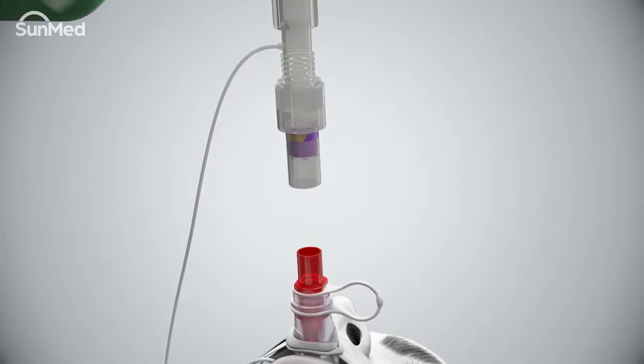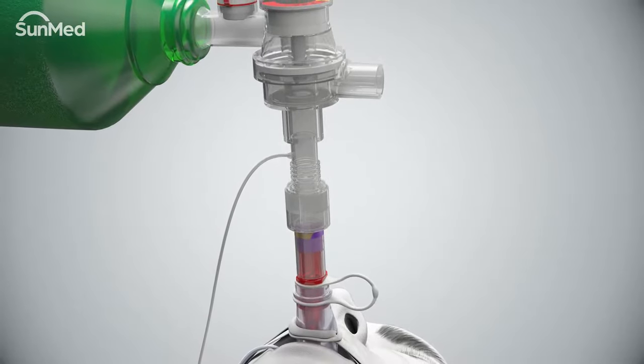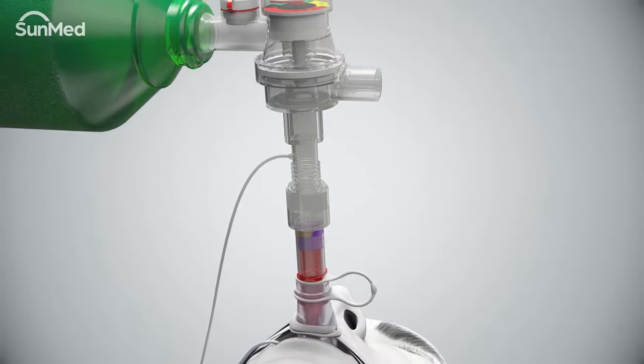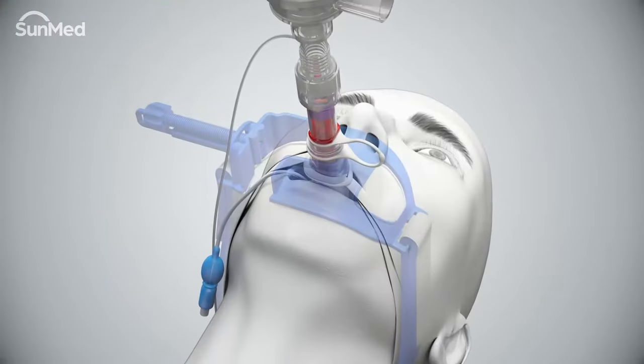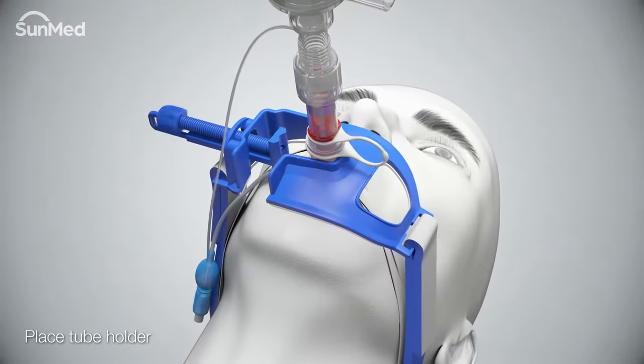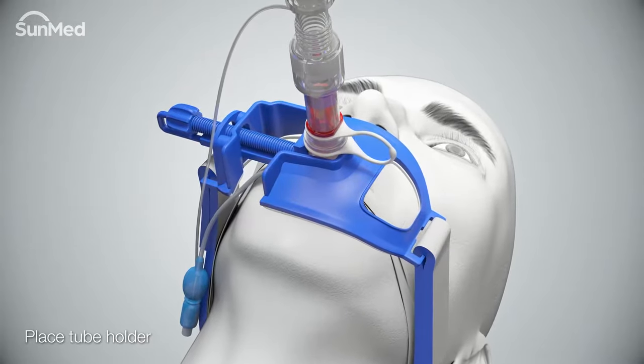Check for adequate ventilation — for example, monitor end-tidal CO2, check for bilateral breath sounds and chest expansion. Secure the device with a tube holder and keep in place until the air Q3 is removed.